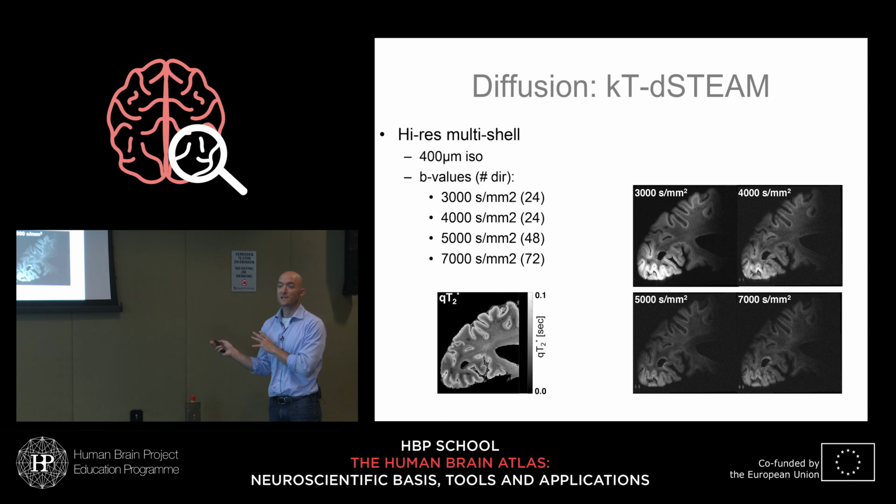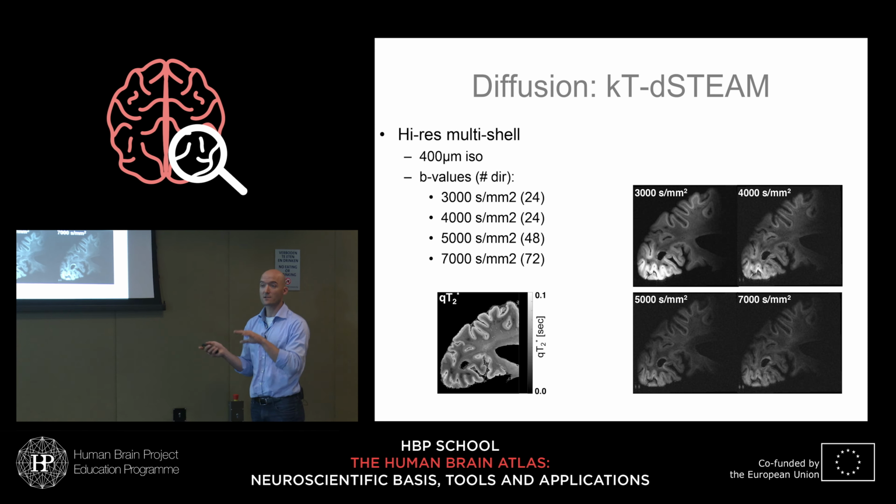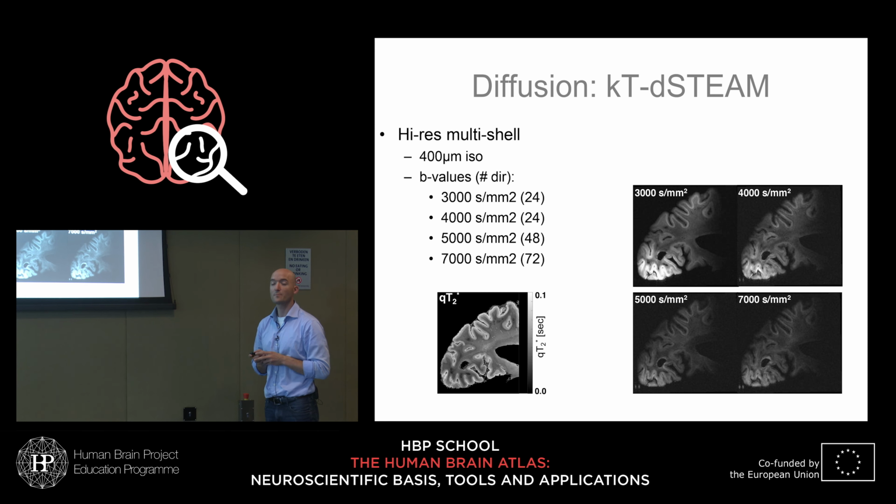And so with this data set, we have, at very high resolution, also the high b-values to get the crossing fiber models, like we mentioned before. And also analyzing over the b-values, we can do some more complex modeling frameworks in diffusion MRI, such as NODDI, such as the diffusion propagators, such as CHARMED, that allow you to look not only at the local direction, but it also, for instance, can tell you something about what is the fiber density there.